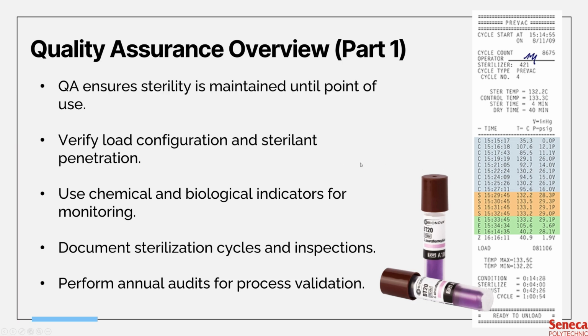And every cycle must be documented. This includes sterilization printouts, load contents, and operator initials. Finally, facilities must conduct annual audits for process validation. We have to validate that procedures are being followed and that equipment remains in proper working condition.